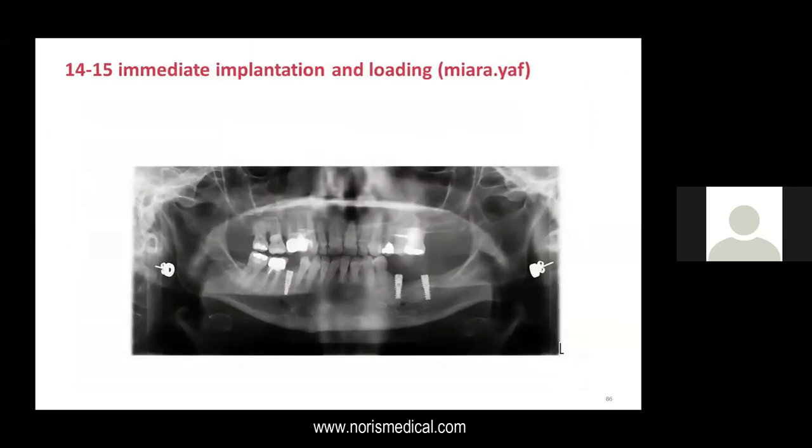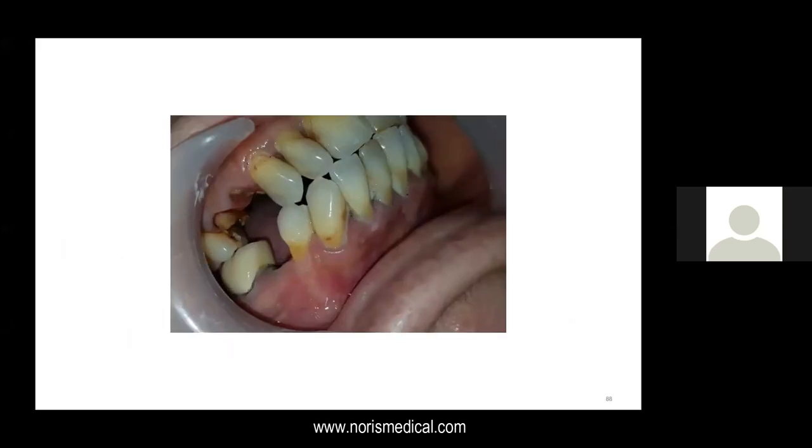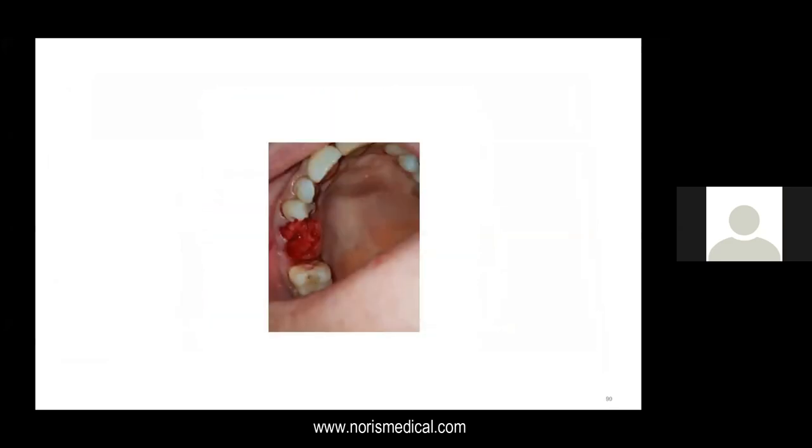And that's it. Teeth number 14 and 15. The teeth are here. In this case, the teeth are fractured. So again, same day, one hour, and the patient has a result. Usually the patient comes in a dramatic state. Look how it looks, I have to have a solution now. We are living in Israel after all. So this is how it looks, and this is the bone.